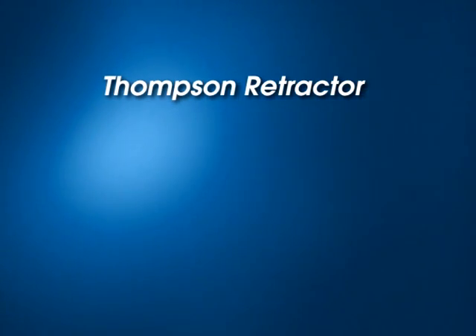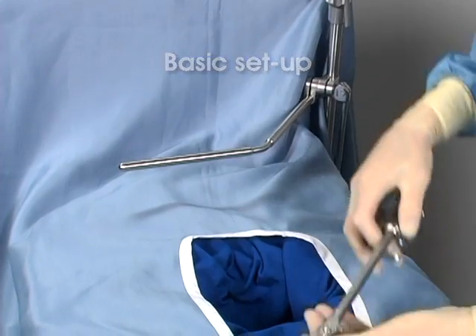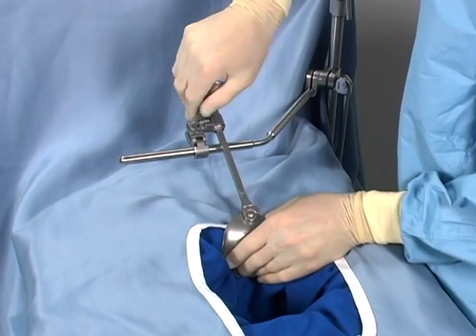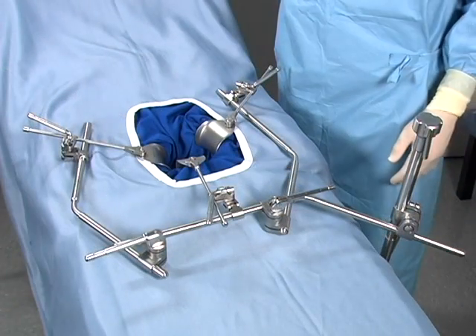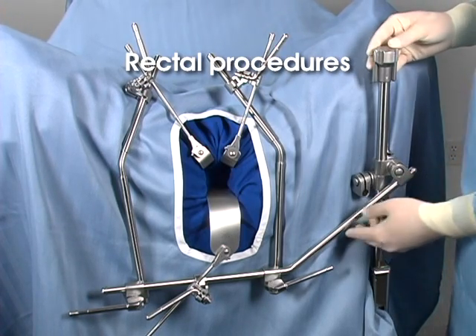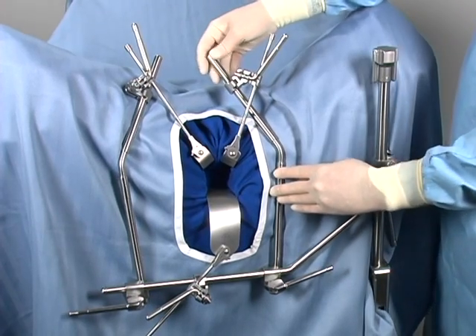The setup demonstrated thus far has been for upper abdominal incisions. Other setup possibilities will now be demonstrated. For a simple basic setup, attach the rail clamp to the table and secure an extension arm to its joint — one or two retractor blades may be added to the arm. This feature is exclusive to the Thomson Retractor System. For lower abdominal procedures, mount the rail clamp at the foot of the table for unobstructed access to the surgical site for large bowel and colon procedures. For rectal procedures, attach the rail clamp to the distal end of the table. The crossbar can then be positioned below the incision to facilitate downward retraction, and lateral arms can conform to the patient's anatomy, providing low-profile lateral exposure.